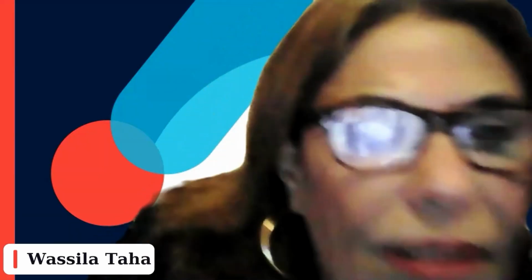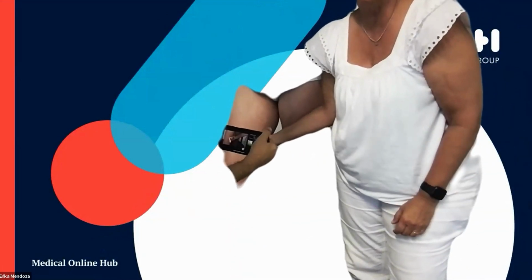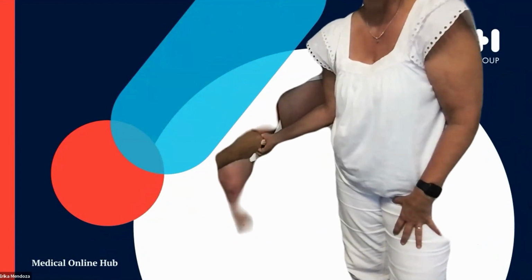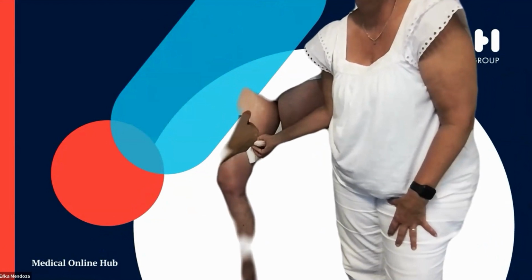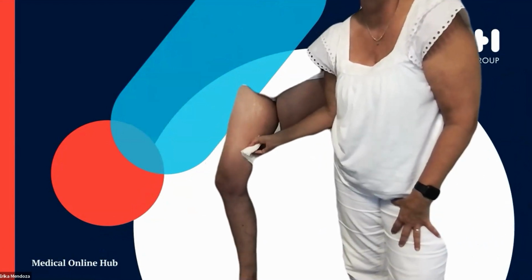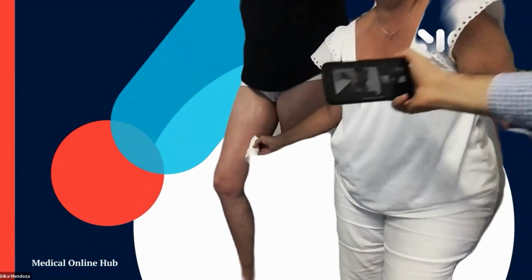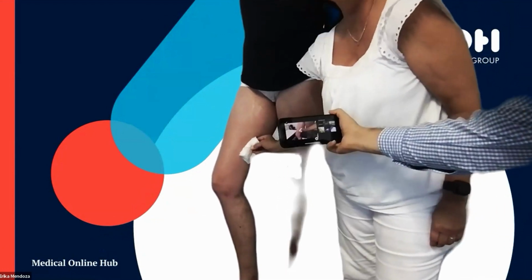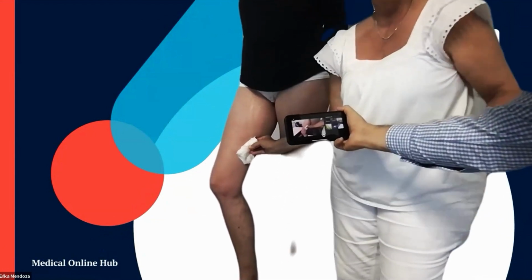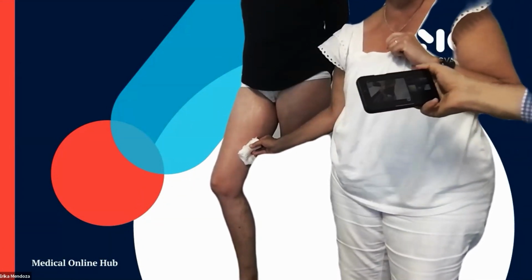So I would put these things over the leg. But you have to clear the background because I can't see. Can you move the background, Dr. Erika Mendoza, please? Okay, good. You perhaps see that I have extra compression here. I will put this inside the stocking to allow a better, more central compression on the perforating vein after the sclerotherapy.